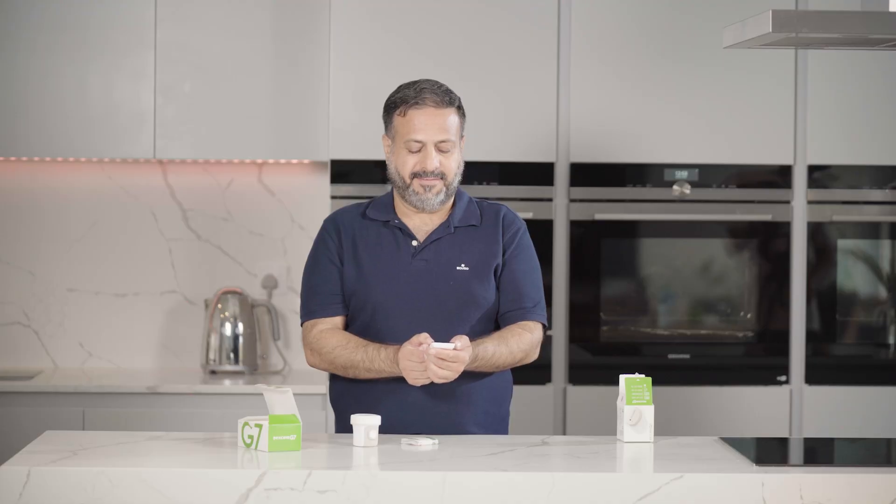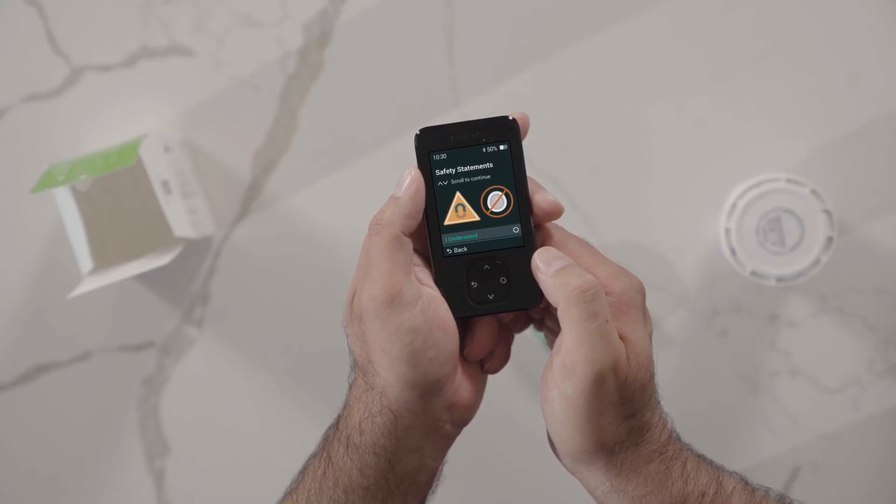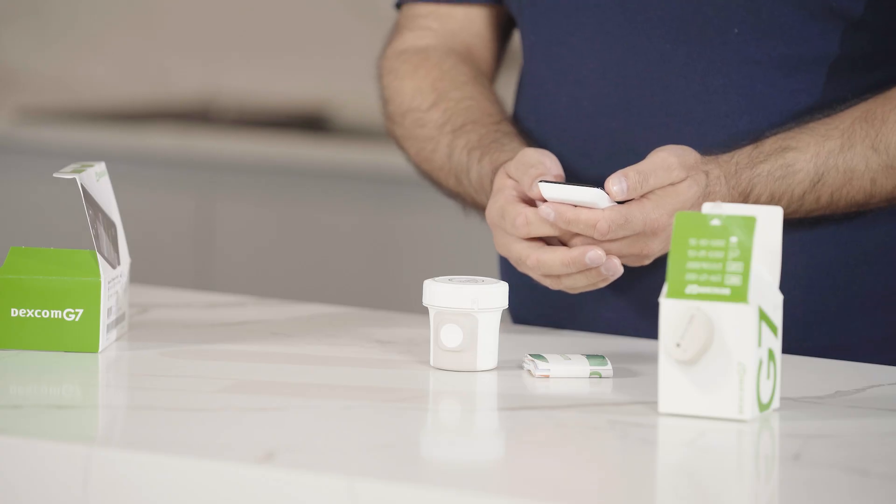The receiver will then display a series of educational screens so you can learn about your G7. This in-receiver mini tutorial will teach you all about safety, treatment decisions, alerts, trend arrows, and reading your home screen.